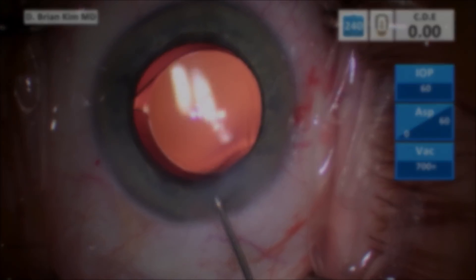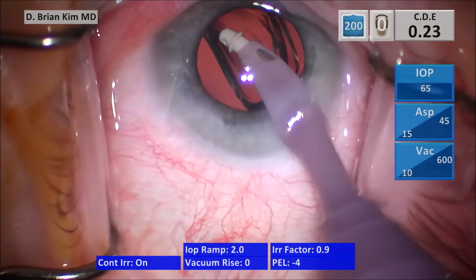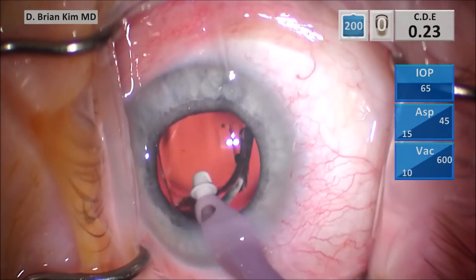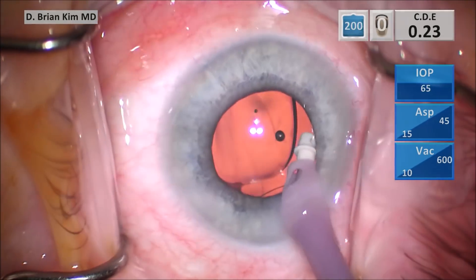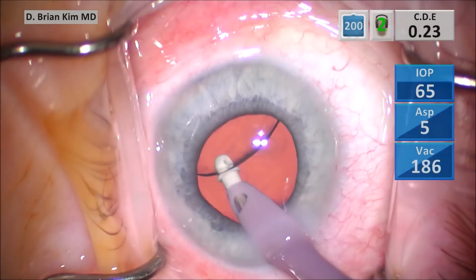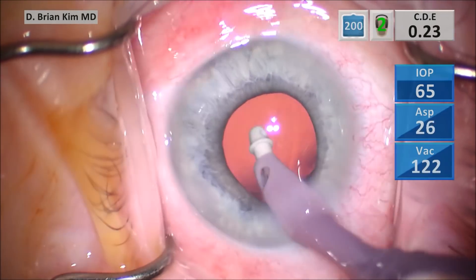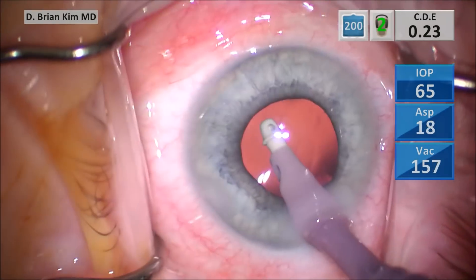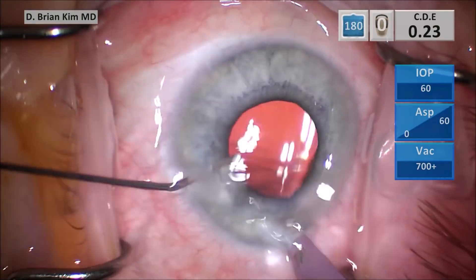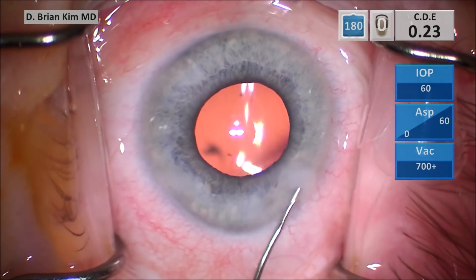Each of the cases coming up are going to involve smaller pupils, but because the technique is the same and consistent, you can be confident that the entire lens is within the bag. You rotate the optic 90 degrees and tilt it up to get the viscoelastic out. You're confident that the haptics are within the capsular bag because of this maneuver. Make sure the chamber does not collapse by performing the fluid exchange, then hydrate your incision.